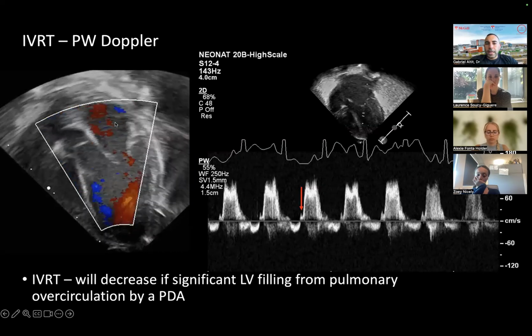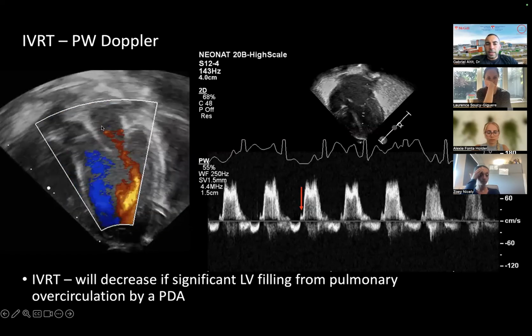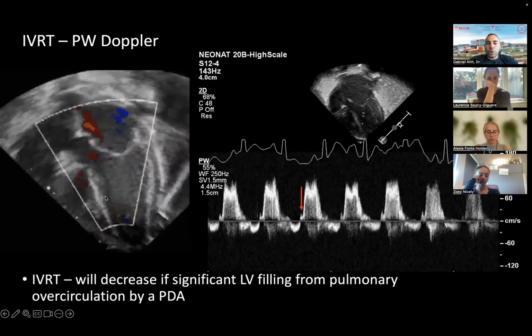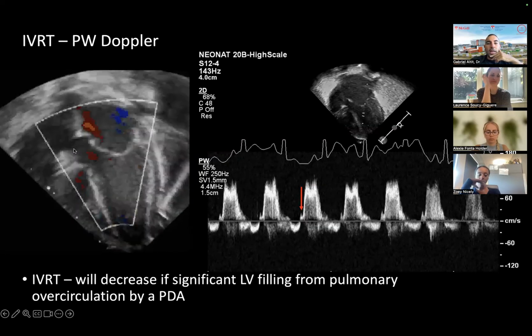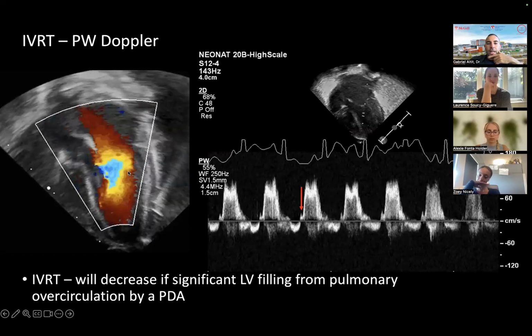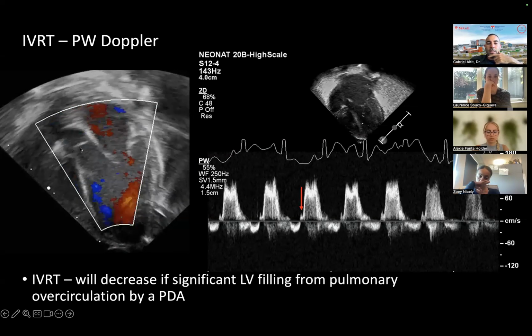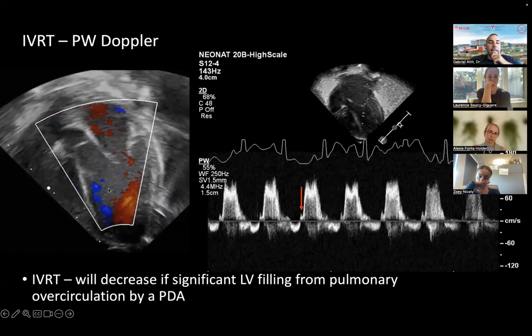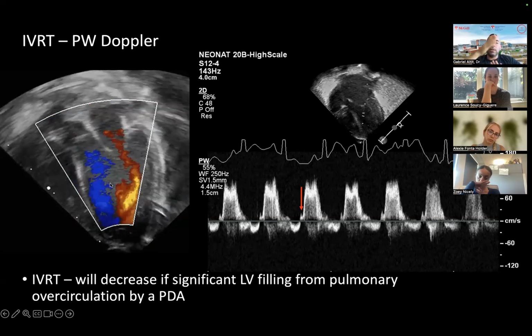You see here the LA, you even see a pulmonary venous flow filling your LA. Your LA is filling through the mitral valve into the LV, swirling into the LV outflow tract and filling your aorta. So you get inflow directionality that's red in diastole and then blue in systole. Then you want to get your pulse wave Doppler exactly at the junction between the red and the blue, so it's the junction between the inflow and outflow.